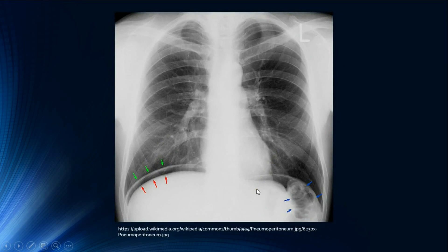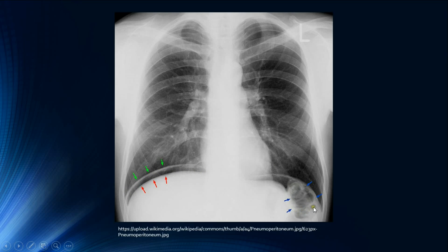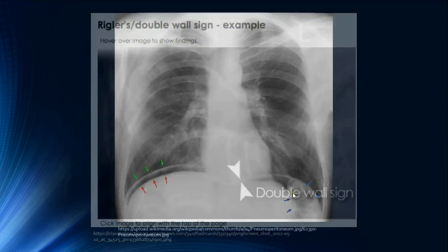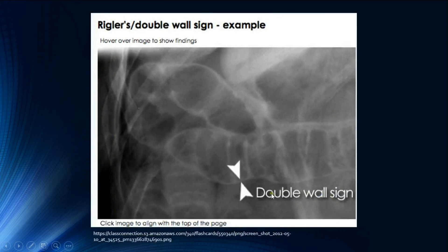For pneumoperitoneum signs: whenever visceral perforation is suspected, the best next step is an erect PA chest radiograph, as free air under the diaphragm is best seen there. This is called the crescent sign. Another sign is the double wall sign (Rigler's sign): gas surrounds both sides of the bowel wall — intraluminal and extraluminal — making the wall visible from both sides.